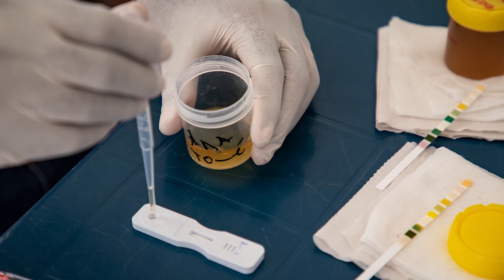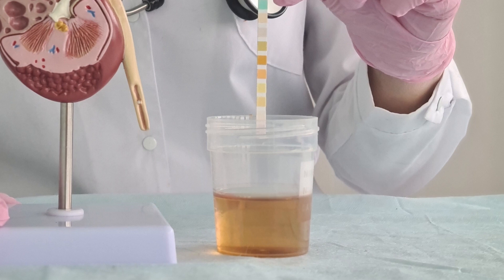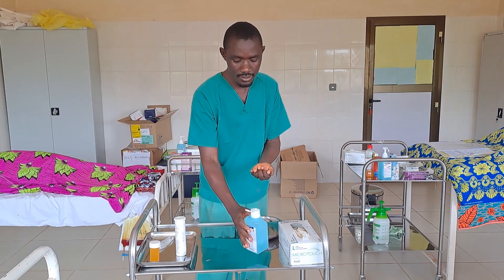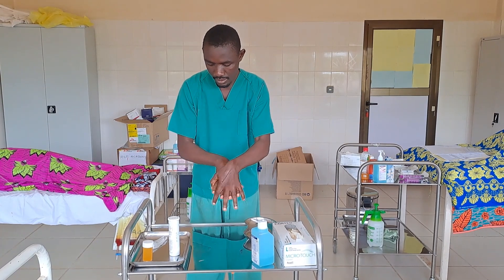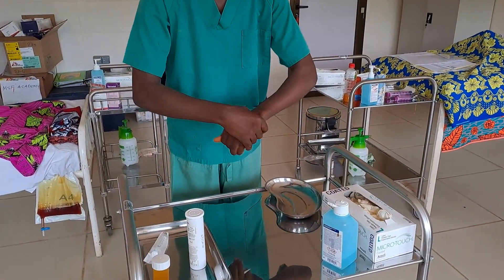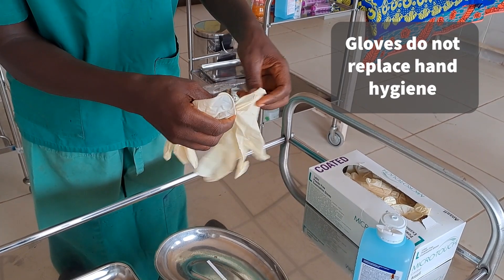Let's go on to the procedure. This procedure can be performed two ways: the first is to keep the sample sterile using a sterile syringe, and the other is to dip the reagent strip directly into the urine. We will now walk you through the steps and show you the different methods. We start by performing hand hygiene as we are about to begin a procedure. Don non-sterile gloves, as some pathogens can be directly transmitted through urine. Gloves are indicated to avoid skin contact with urine. Remember, gloves do not replace hand hygiene.